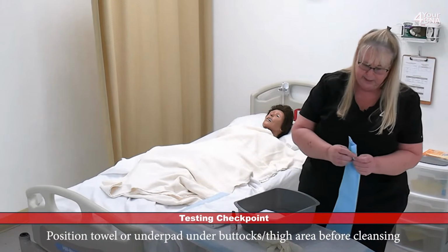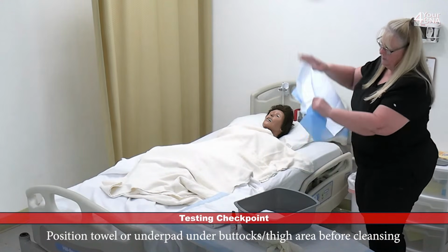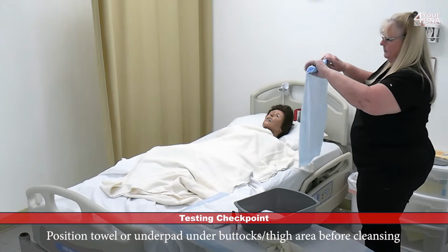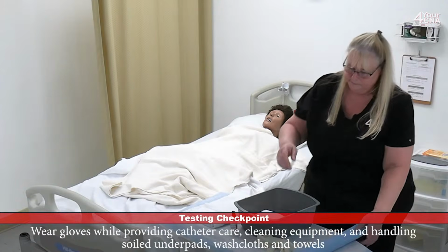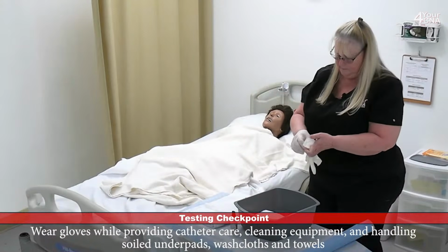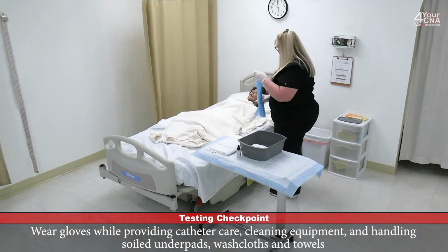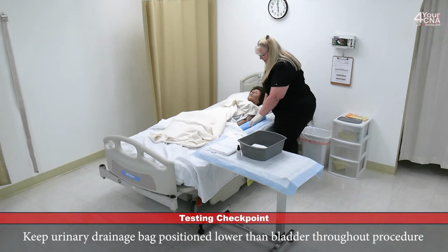And I'm going to prepare the underpad to go under the patient. I'll open it up. I'm going to hold it up lengthwise with the absorbent side facing me, and I'll roll it all the way to the end. Now I can put my gloves on. Okay, Miss Jones, we're going to place an underpad under you to keep your sheets dry while we do this skill. So I'm going to place an underpad on the bed.